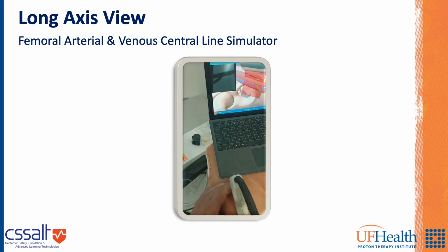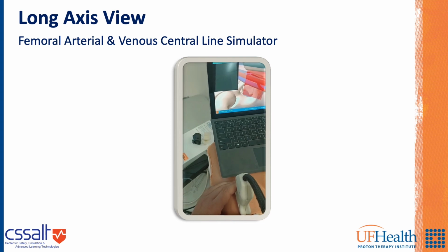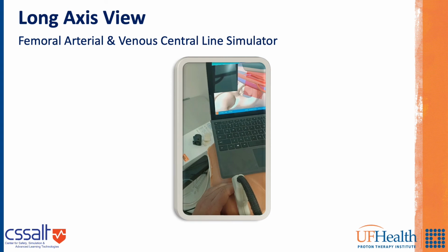The simulator allows applying the long axis in-plane approach as well as the short axis out of plane, as shown previously. In this approach, the long axis of the ultrasound probe is placed parallel to the long axis of the femoral artery. If done correctly, the needle appears as a long hyperechoic white object.